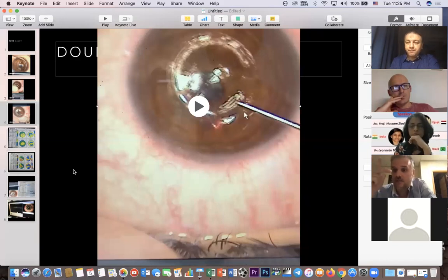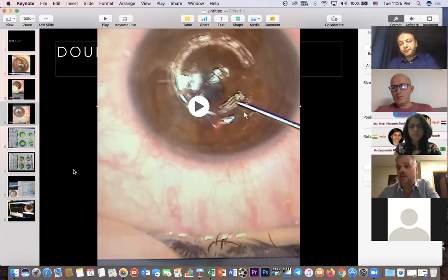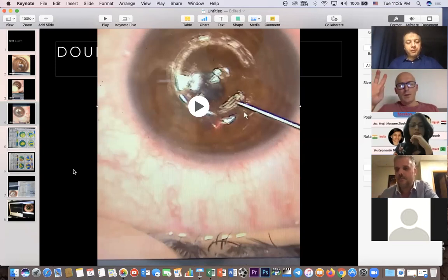With these three visual acuities, I can know if the patient has a good potential visual acuity. If with the scleral lens he has 8 out of 10, and with the glasses he has 1 out of 10, I will go for rings. But if with scleral lens the visual acuity didn't increase, I don't do the surgery, because it gives me the evaluation of the amount of high order aberration. So for every case, I do these three visual acuities, and I decide if I will go for rings or not. Okay, perfect. Very good point.